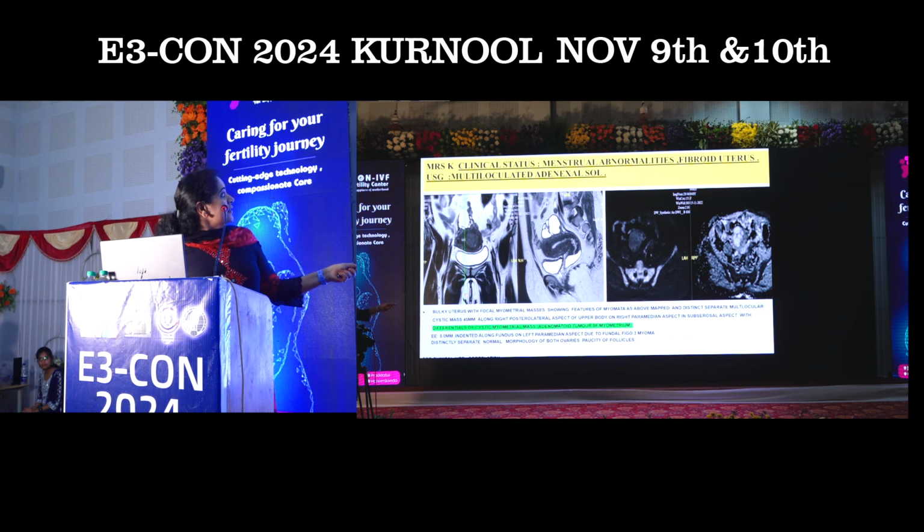So this was interpreted as an ovarian adnexal mass. But here, when you see, there is a submucous fibroid. I am trying to trace the uterine serosal contour. This is in continuity with the uterine serosal contour. So it's a uterine mass and not an ovarian lesion. This turned out to be an adenomatoid tumor of the myometrium.